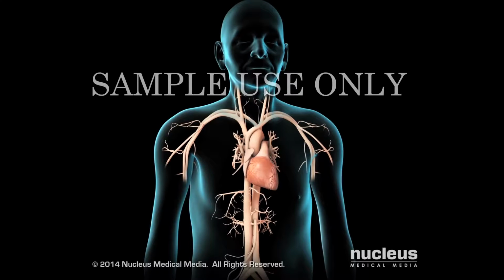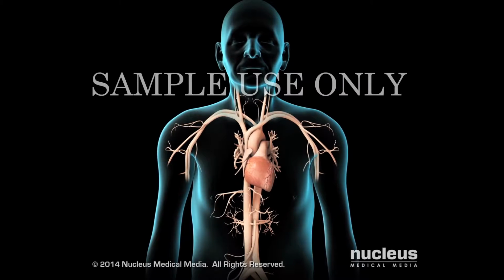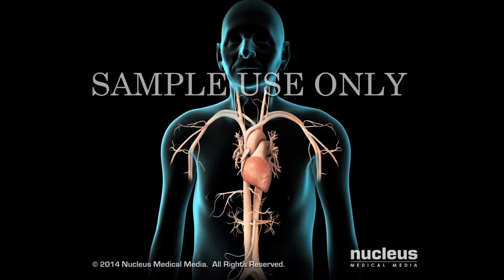If you have a severe problem with the aortic valve in your heart and you can't have open heart surgery, your doctor may recommend a transcatheter aortic valve implantation.